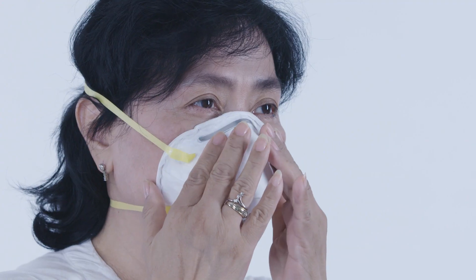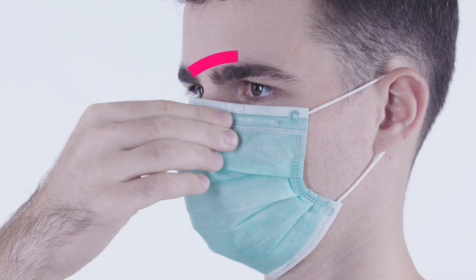With both hands, gently press any nose clip so that it fits well across the nose and onto the face below the eyes. Do not pinch the clip.